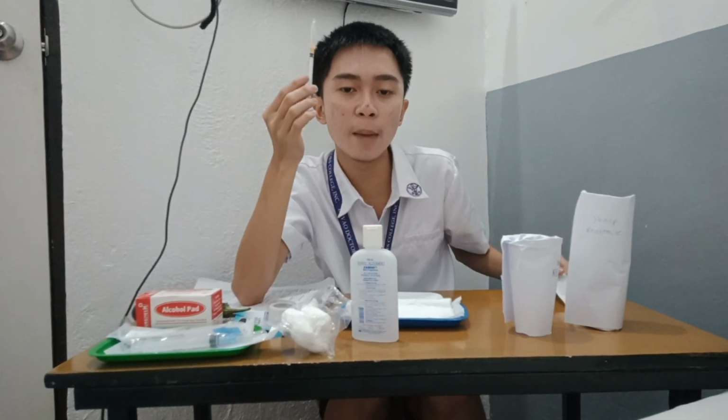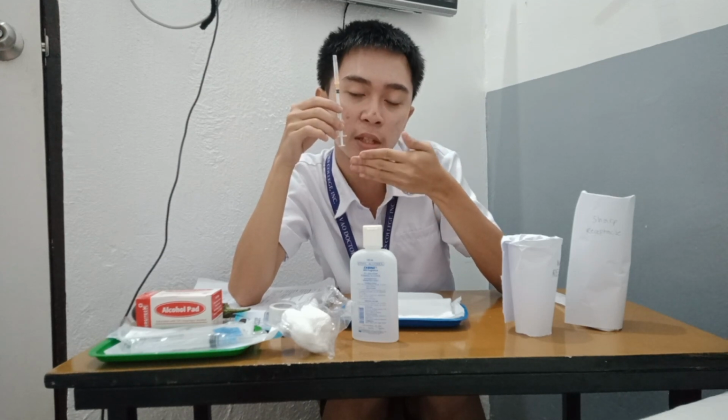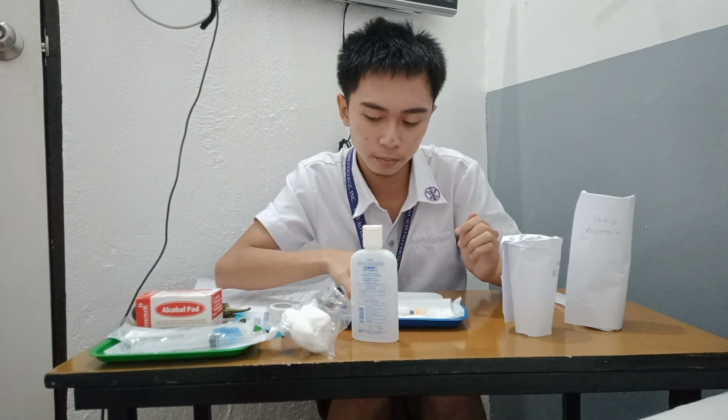And now I'm going to put this on the hypodermic tray, and I'm going to write the medication ticket so that we won't forget the medication, the dosage, and who it is assigned to.